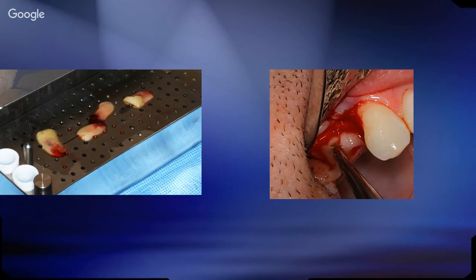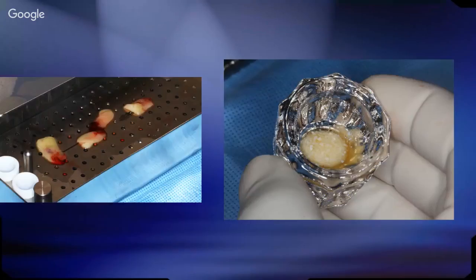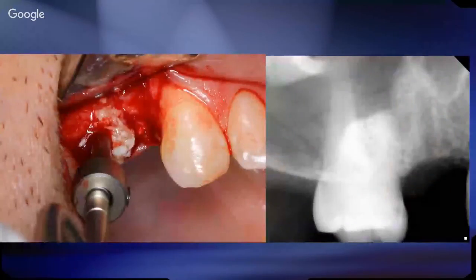So we'll put a PRF membrane in, then we'll go in with the osteotome, and it's designed to go into the surgical guide, and we'll actually push the membrane up using the osteotome with just hand pressure. We'll then keep adding increments of bone, pushing ahead with the osteotome. And once we've got the site lifted, you can see there in the picture on the right-hand side how we've created an osteotomy, and also we've pushed the graft material ahead of it. So we have a nice balloon of graft material around the implant.